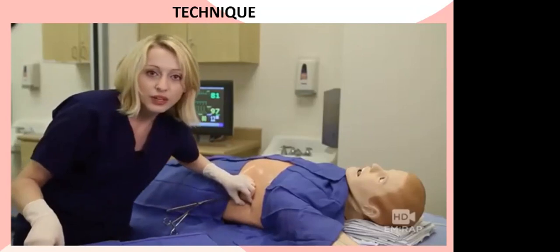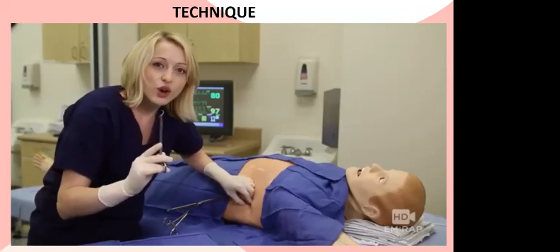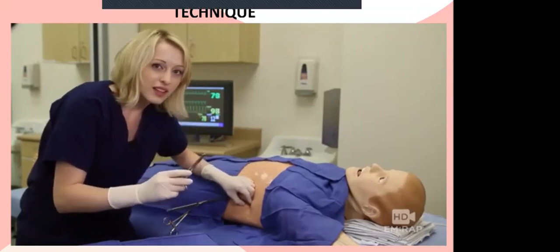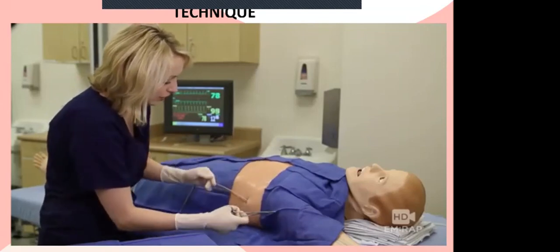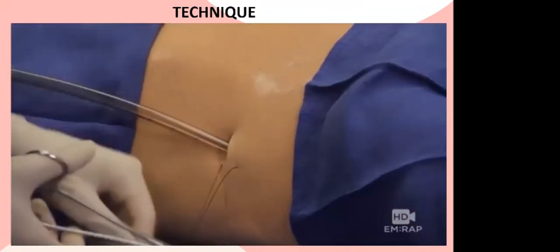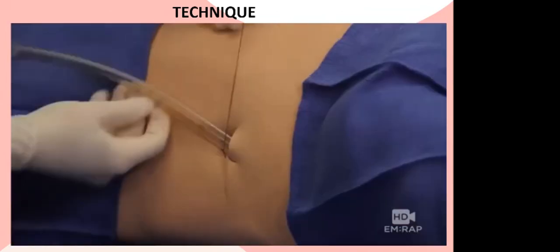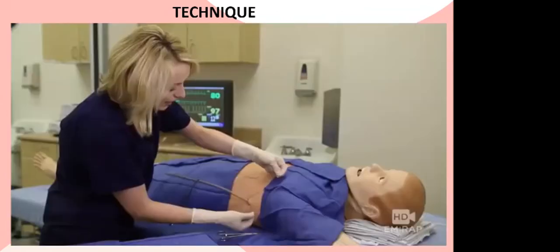Perfect. Now we're going to suture it in place. So get your O-silk, and remember, there's no proven superior method for suturing in a chest tube. Here's one method that I like. We're going to make a simple interrupted suture on one side, pull through so you have equal ends of suture on either side, and tie a surgeon's knot. This is your anchoring knot. Wrap the ends around the tube and tie.